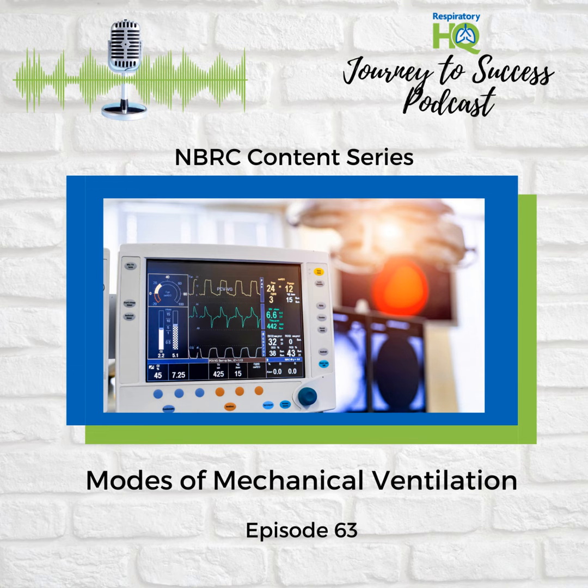Now, I know we've been focusing a lot on modes that primarily control the volume of air delivered, but there's another category of modes that you've been researching. Pressure-controlled ventilation. Yes. I'm curious to hear more about how that differs. So instead of setting a specific tidal volume with pressure-controlled ventilation, we set a target pressure that the ventilator will deliver. This allows the volume of air delivered to vary depending on the patient's lung compliance.